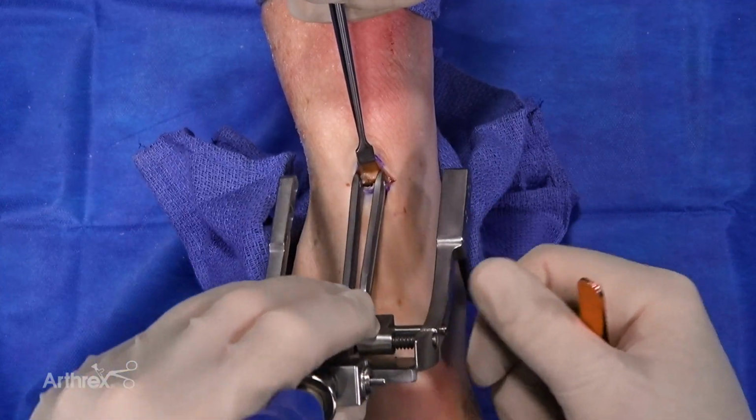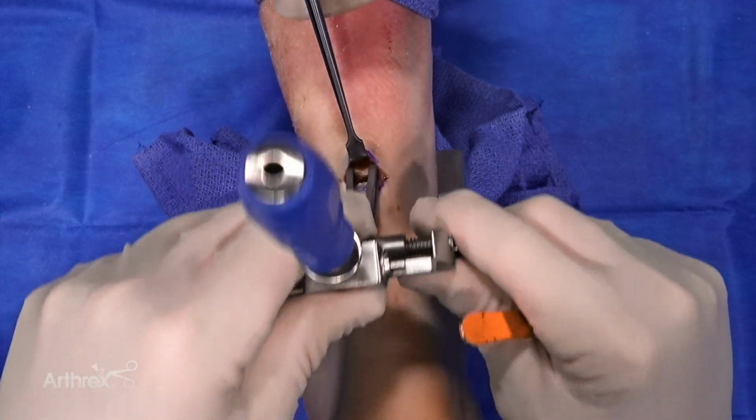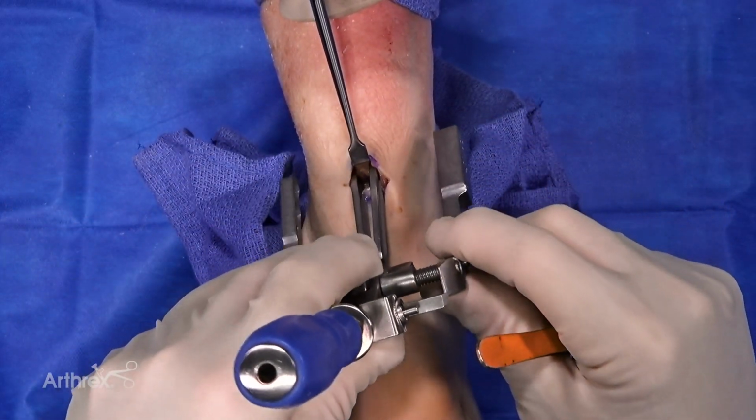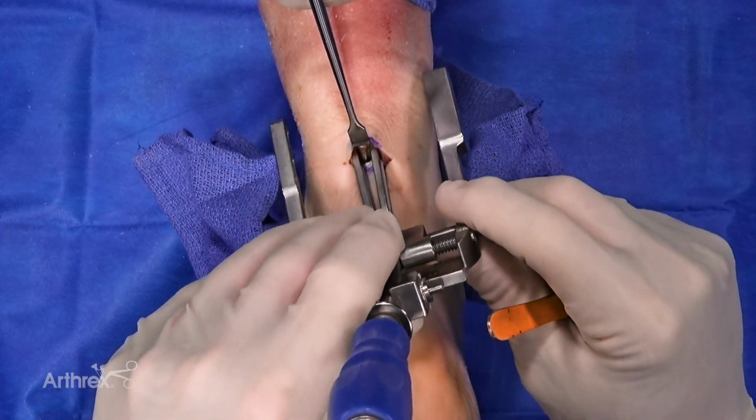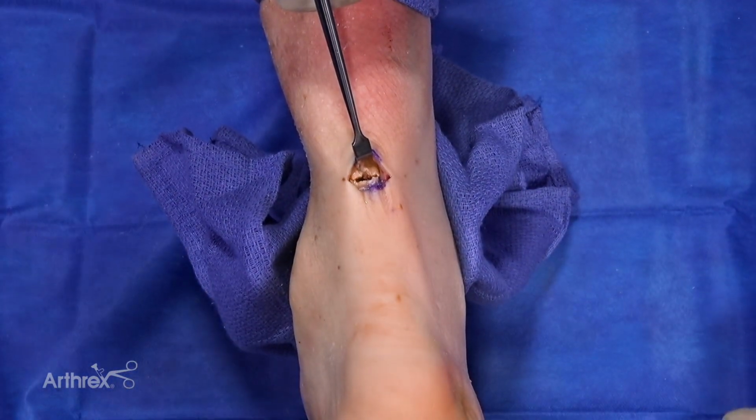So what we've got now here is the device. We slide it through with the tines closed, and then we capture both sides of the Achilles tendon. Now you'll see as I do this, oftentimes the Achilles tendon will be pushed up proximally. So the trick here is to go ahead and take an Alice clamp.